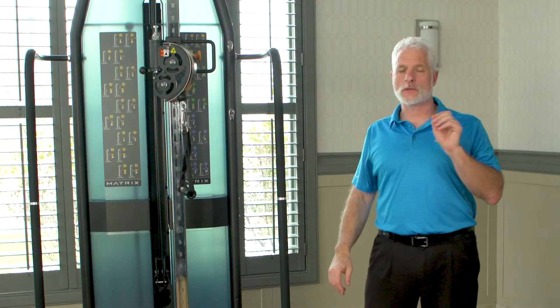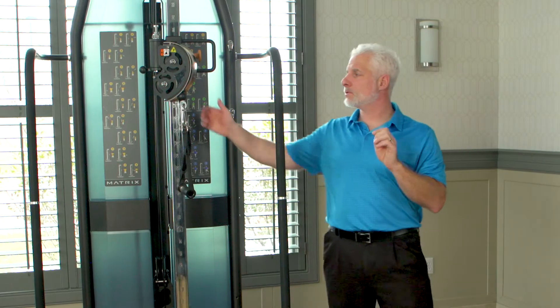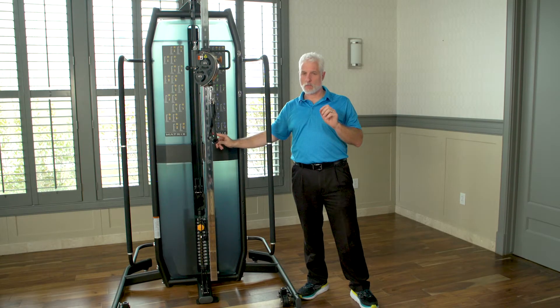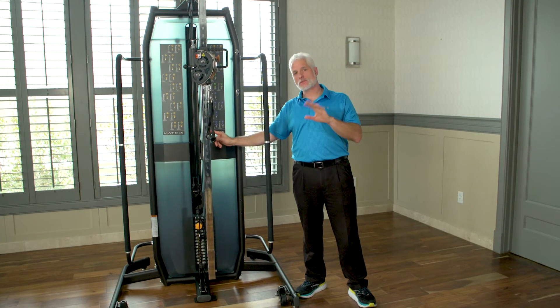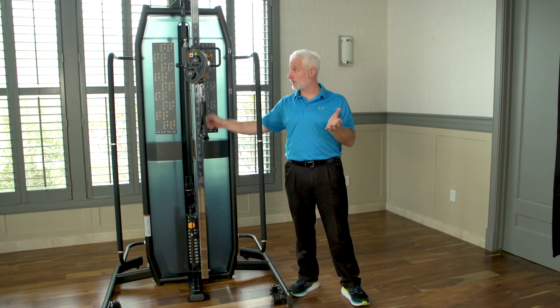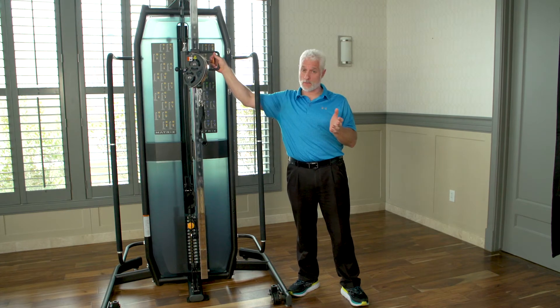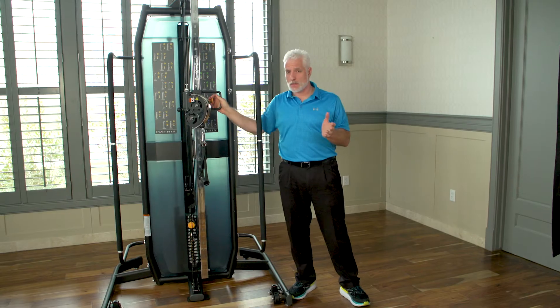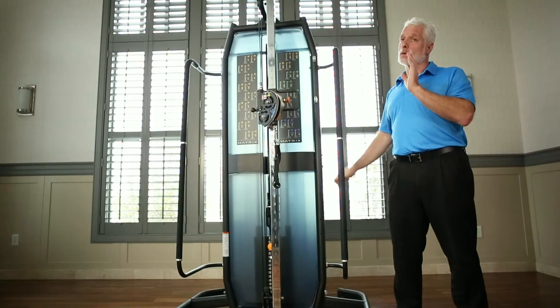The adjustable pulley gives you the ability to change angles and various heights more than any other machine, and that gives you the versatility for rehab. What's nice about this machine is it's very easily adjustable — I can use one hand, grab the bar, and pull it, which is so much easier than having to hoist it up in the air when other machines aren't working correctly.